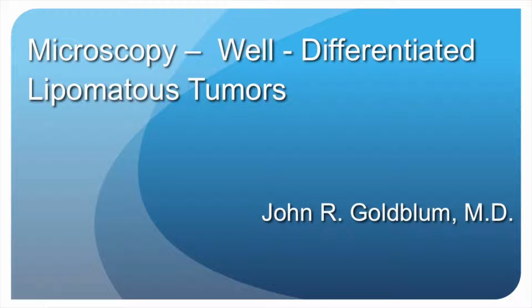What I'm going to do is spend about the next hour or so just showing you some cases of well-differentiated lipomatous tumors. Many of these cases come from our consultation files and really represent the most common types of consults that we see. In fact, well-differentiated fatty tumors are one of the most common consults that we see overall, and these are pretty representative of these. Some of these have specific clinical histories, others do not. I'm going to limit showing any immunohistochemical stains, but I can tell you when there are relevant immunohistochemical stains and or molecular studies that are pertinent to a given case.